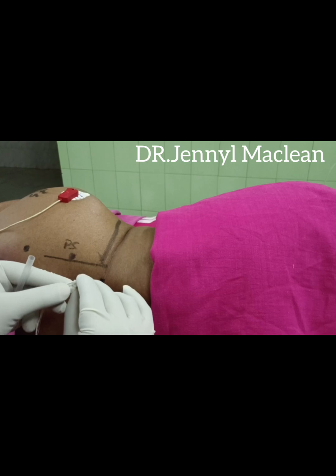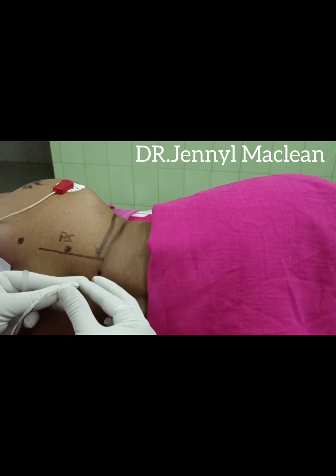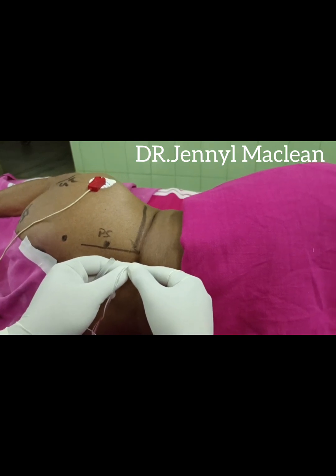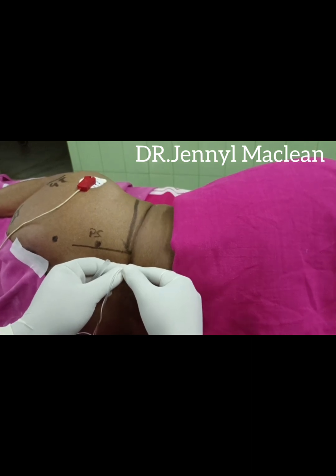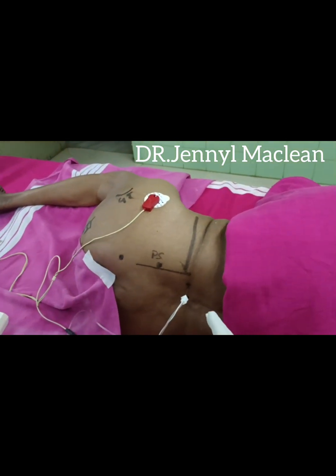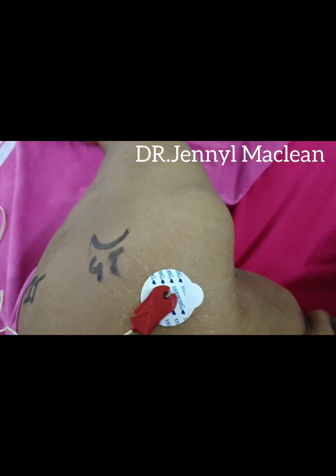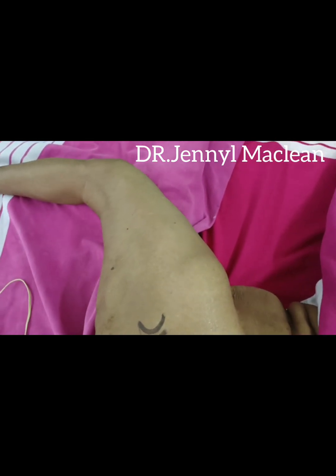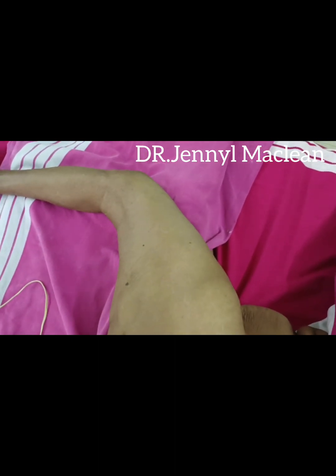Keeping that in mind, after you hit the transverse process, the middle finger of both hands is placed on the needle leaving 2 cm from the skin, which is kept as a guide so that you don't advance the needle too far and avoid complications. You have now elicited quadriceps contraction.